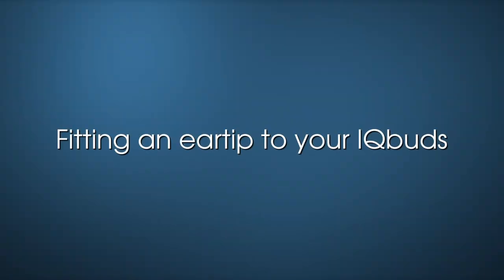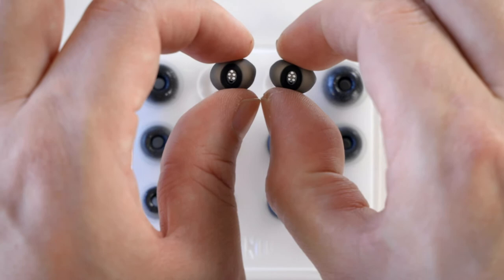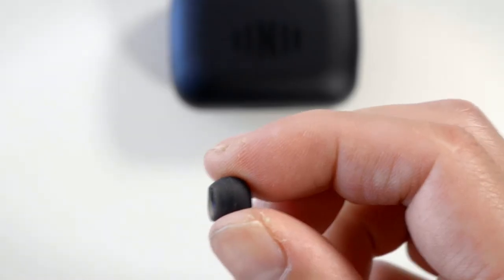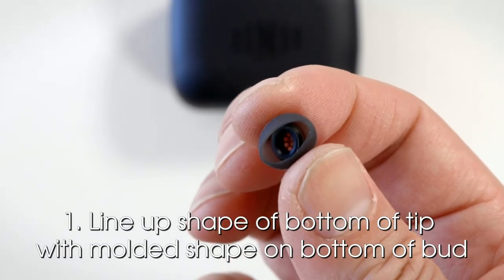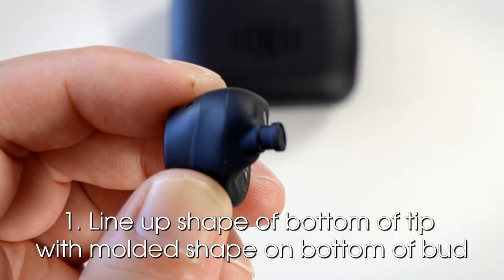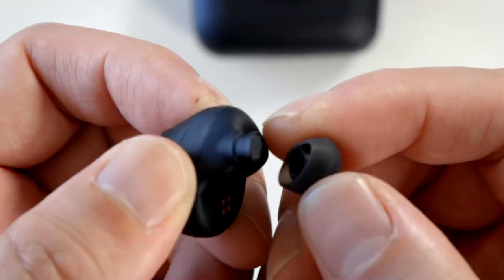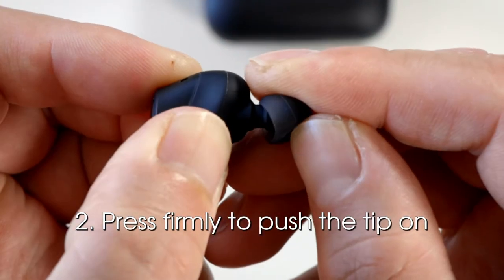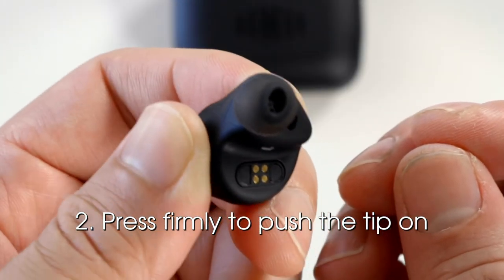Fitting an ear tip to your IQbuds. To begin testing your ear tips, take a pair of tips from the plastic blister pack. To put an ear tip on a bud, first line up the inner shape of the bottom of the tip with the moulded shape on the bottom of the bud. Then press firmly to push the tip on. Do this for each bud.